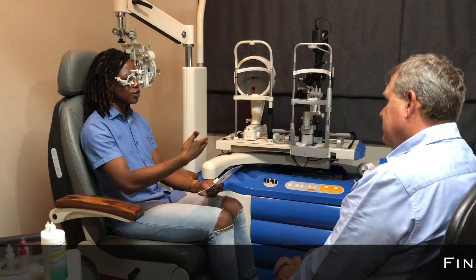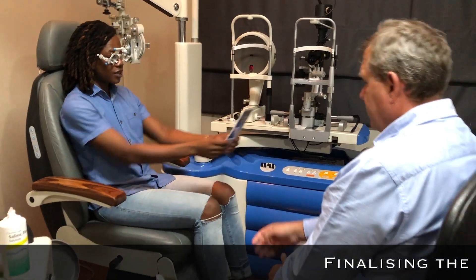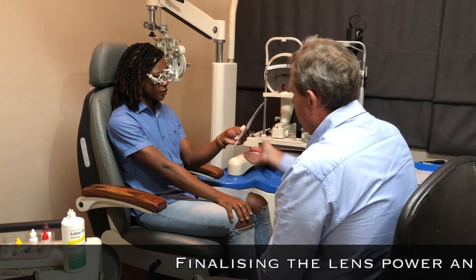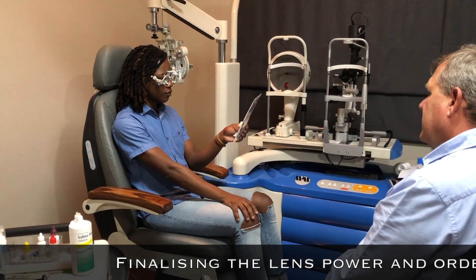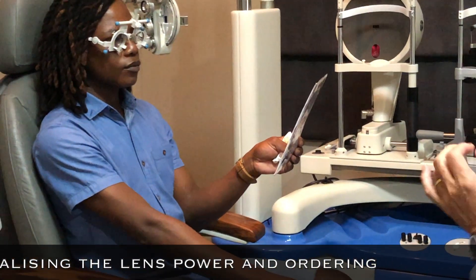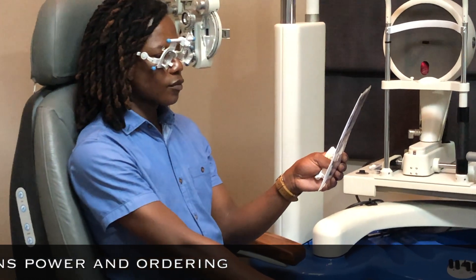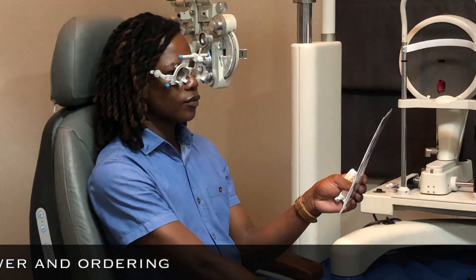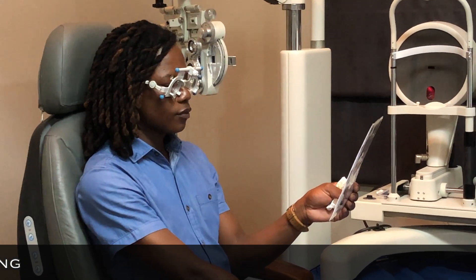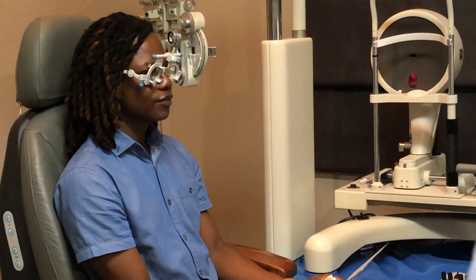Now if I'm on the laptop — with this you can get distance, you can even read the small print. So this gives you as close to normal vision as we can possibly get. Now with the lenses you have on, they're obviously too weak, that's why we've got the glasses in front. You'll see even better with the final lens than you see now, because this is just the best lens on the front. And I notice the comfort's already better.